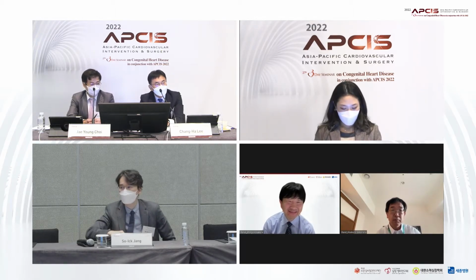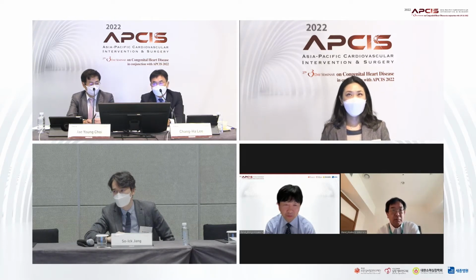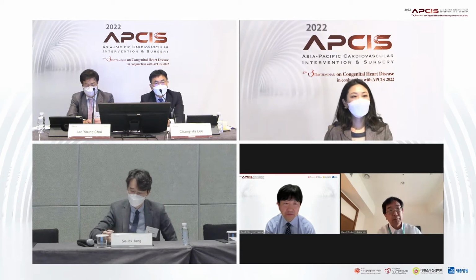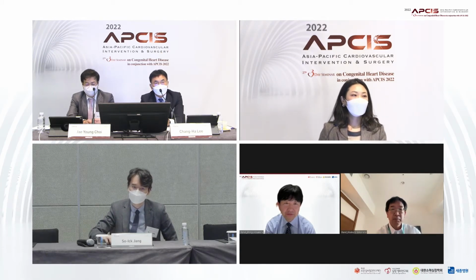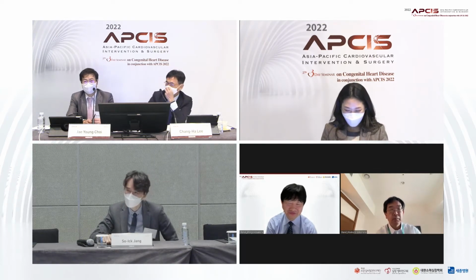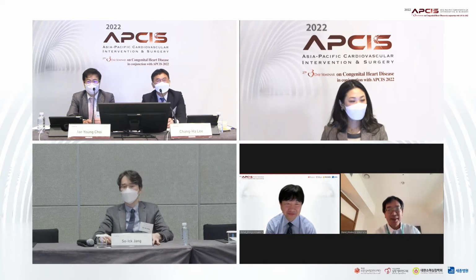At that time, at our conference, the pediatric cardiologist recommended totally removing the stent. Okay, so in our hospital, I do not remove the stent. Right. We just cut the stent and then spread the stent.